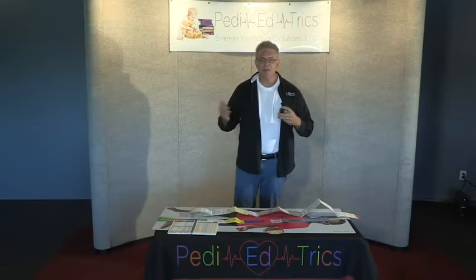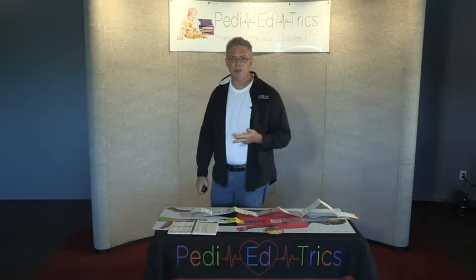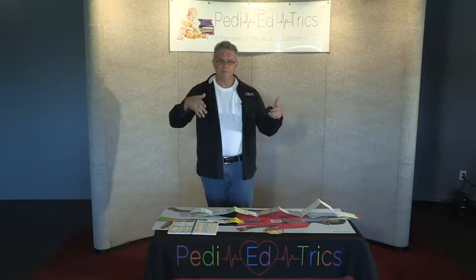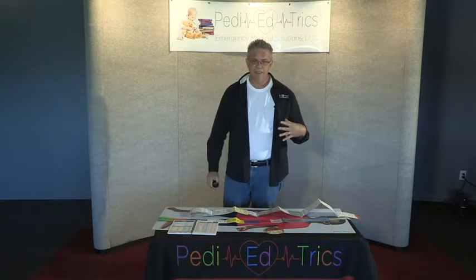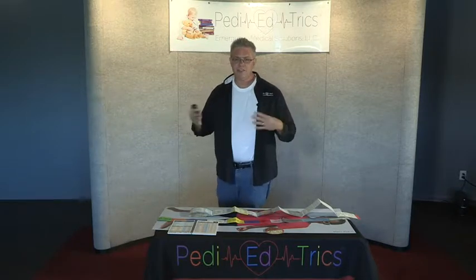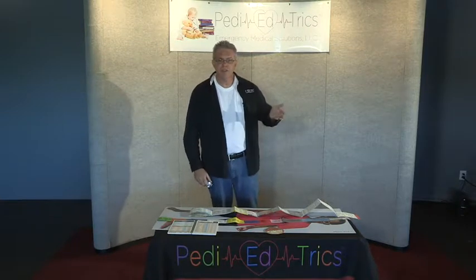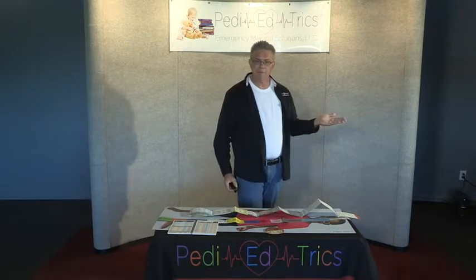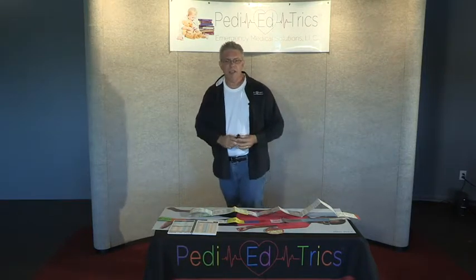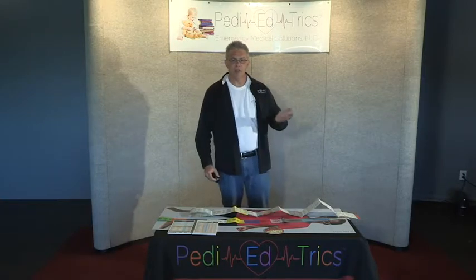And why those numbers are a little different in real life is simple, and that's called everybody says my defibrillator is better than your defibrillator. And it would be easy if people just said one simple amount, this is what we shock with. But with people saying my defibrillator is better than your defibrillator, they all tweak things just a little bit. But you know what? It'll get you in the right ballpark as to how much you have to use to defibrillate a kid. And whether it's Broselow or if you've got Handtevy, if you click or flip, it'll show you how much to defibrillate with as well.